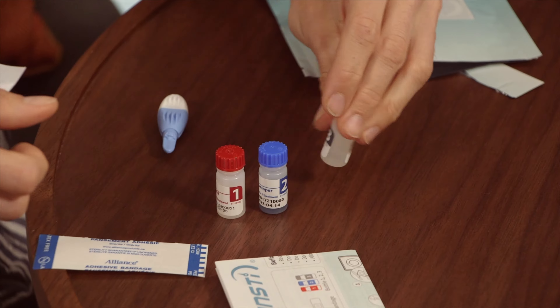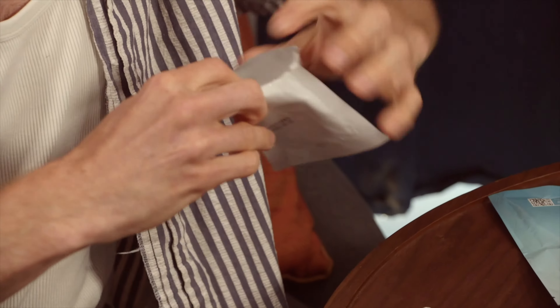First thing you're gonna want to do, open this baby up, then get out all of your materials. Keep that band-aid close, line up your bottles. This one's a little harder. Get out your little tray.